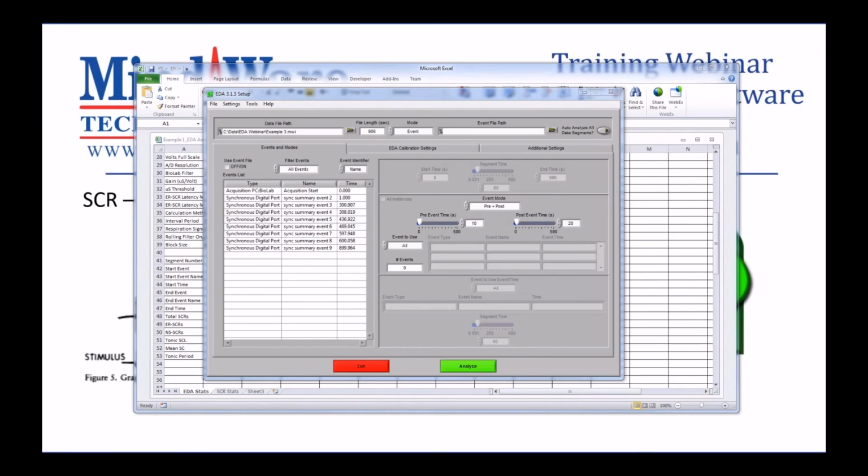Respiration and EDA are sort of interlocked in some very complex ways. And you can elicit a skin conductance response by taking a sniff or a sharp breath through the nose, and you'll see that response occur within that latency window of immediately following the sniff. You'll see that change. And so if you see that, then you're collecting good skin conductance, and you can go ahead and proceed. And if you're not, then you may want to check your electrodes, whether they're fresh or dry. You might want to check the connections to the system, your gain, things like that.